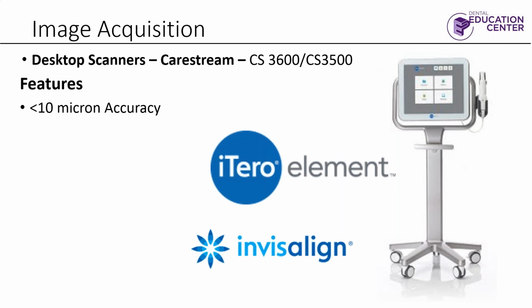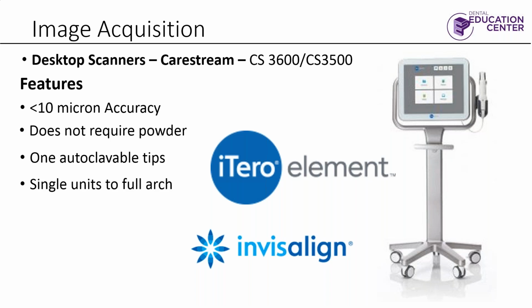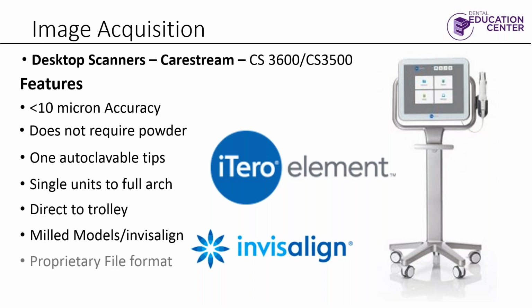iTero was purchased by Align. Align was obviously Invisalign. They came on hot and heavy primarily because of Invisalign, in my opinion. Good scanner, does not require powder. I think it's a very good scanner. And again, I keep saying very good scanner because all these scanners are very close to each other. They're almost cousins.